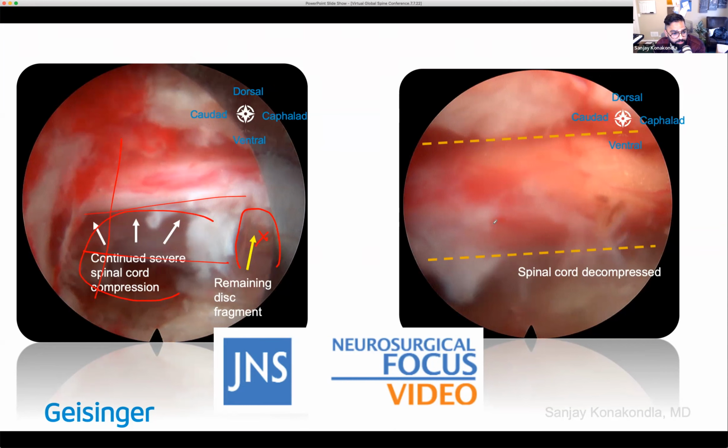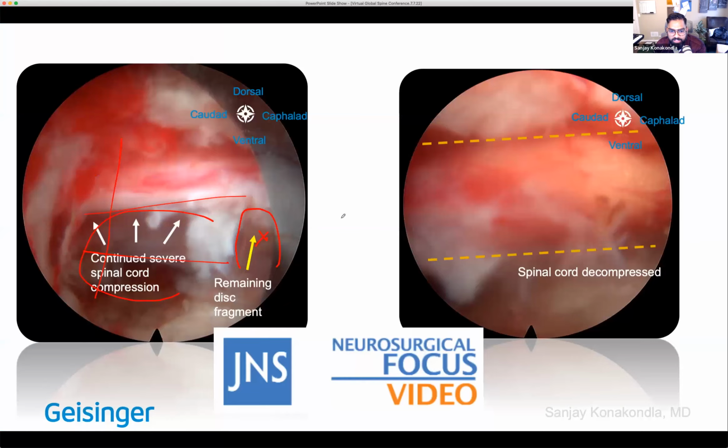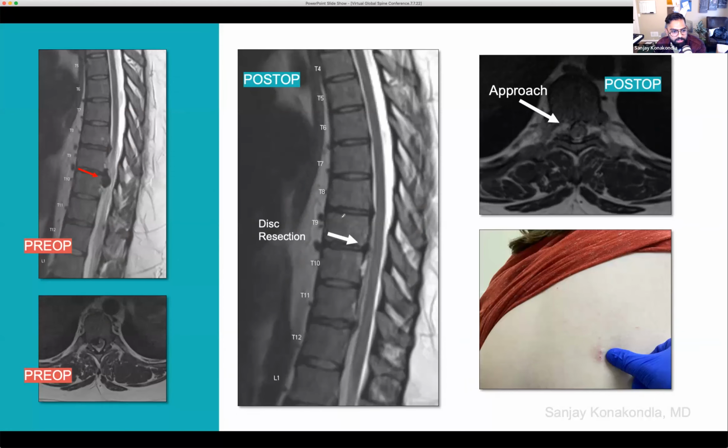We were doing post-operative MRIs earlier on, just to sort of have a proof of concept, just to sort of see what we're doing there. And it's helpful to know what we're seeing in surgery, and sort of correlating it to what it translated to on an MRI is, I think, helpful, especially when we're learning what we're able to do with this.